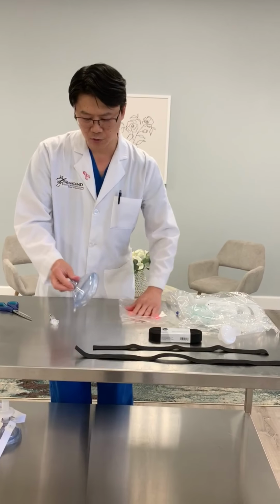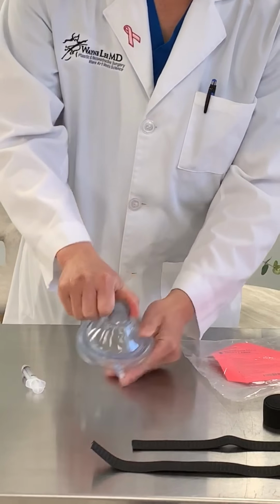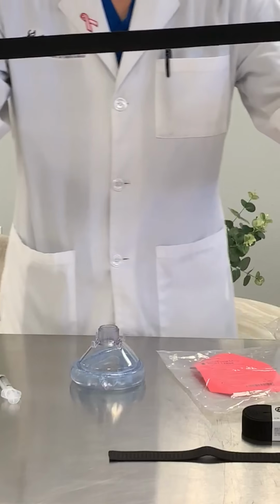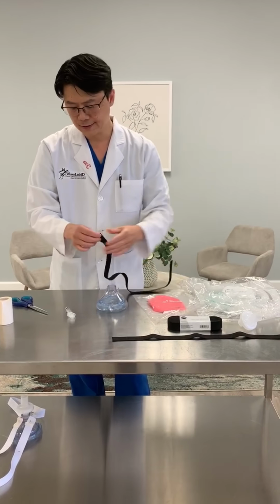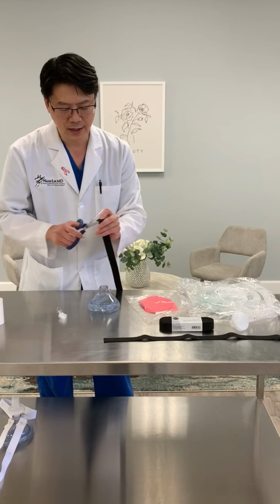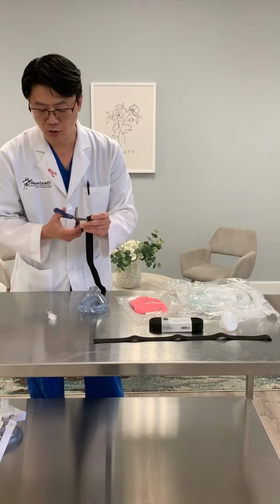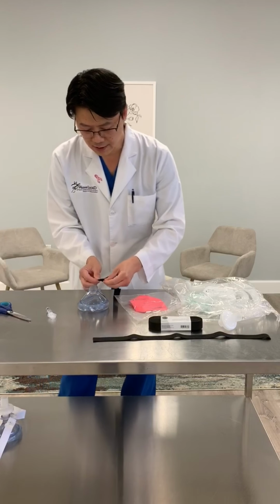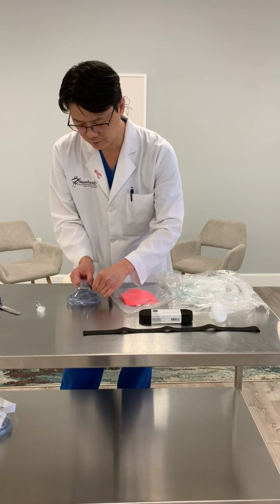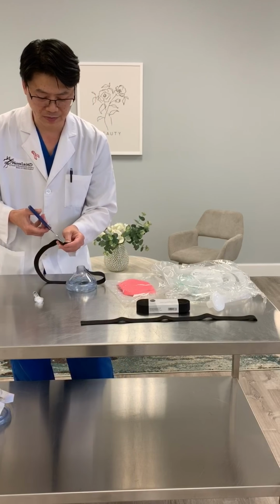There are 4 prongs on this anesthesia mask. You can turn this so that you have 2 on the upper and 2 on the bottom. On the top one, you'll need the slightly larger one. You very carefully use the edge of scissors and just swivel, and you make a gentle opening here. Don't cut it so it won't unravel. And you just place it over this plastic piece, and you wrap it around, and you do the same thing.